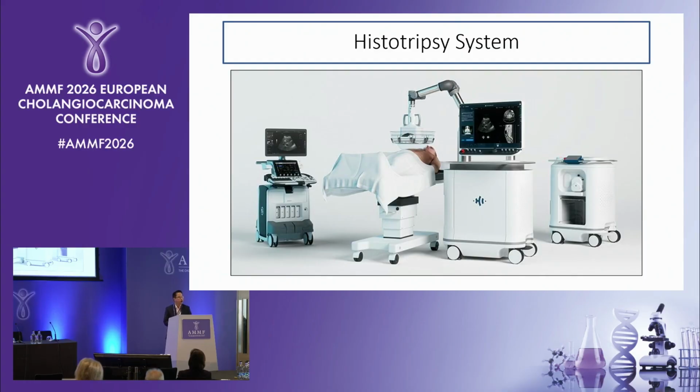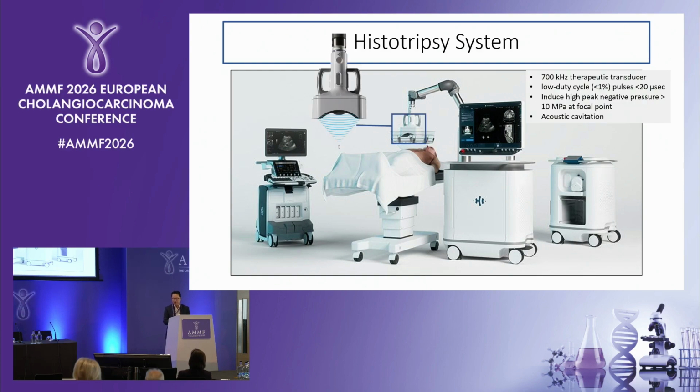These are the three components of the histotripsy system. It consists of an ultrasound system, which you all will be familiar with, and the actual histotripsy system itself, which incorporates the console plus this treatment head, which is the actual ultrasound treatment head for the treatment. Once the voltage is applied, the ultrasound wave will be generated, and it will focus on this pinpoint area here across the liver. And the whole system here is submerged into a water bath.